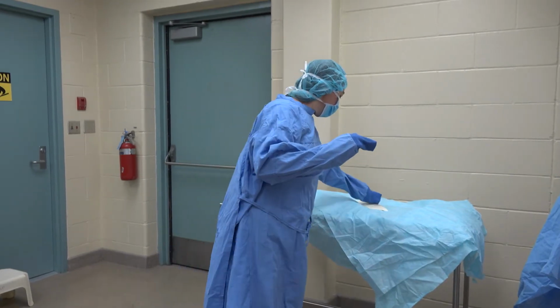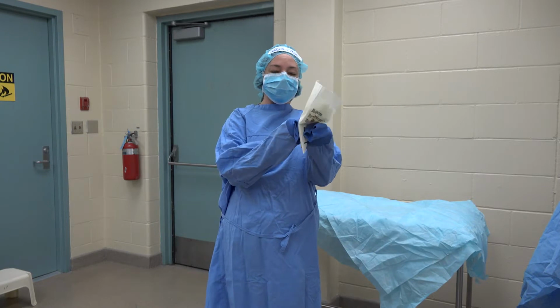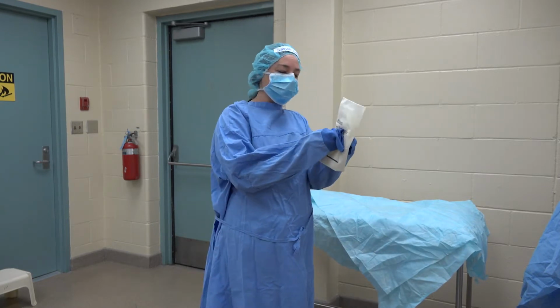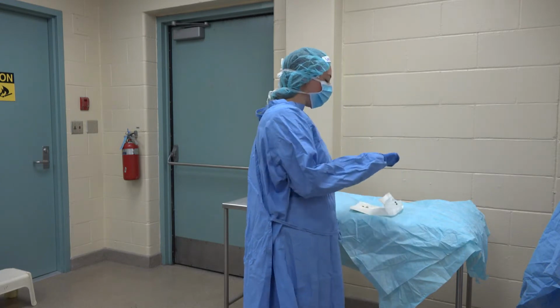All right, so it's now time to put on my gloves. I can manipulate this because I opened them sterilely. And again, only with my sleeves, not with my fingers. All right, and then the right glove.